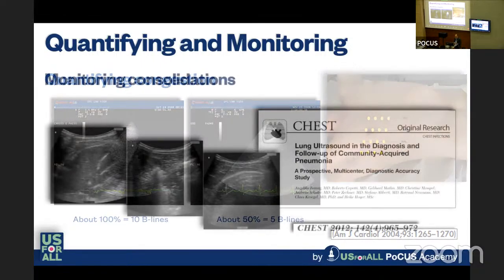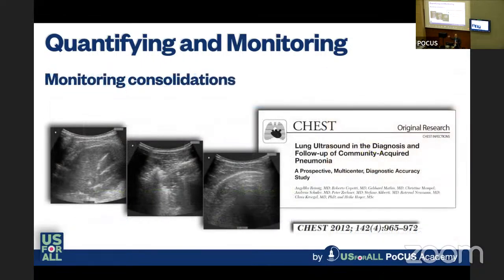And finally, of course, over a long time, you can monitor the changes, for instance, in pneumonia patients. So you can follow up the patients just assessing the size of the consolidation, like it was demonstrated in this paper published in CHEST in 2012.